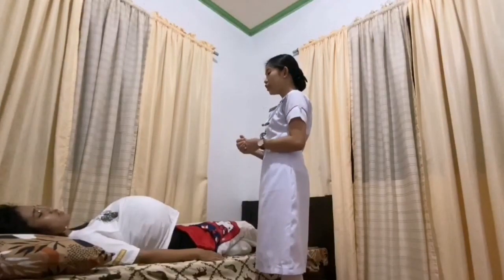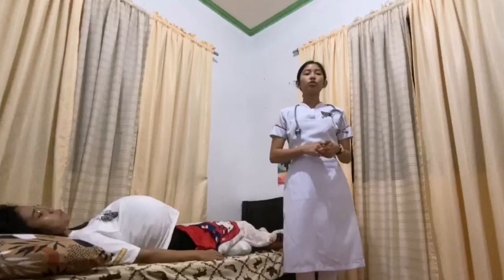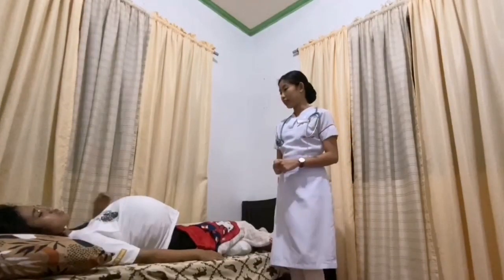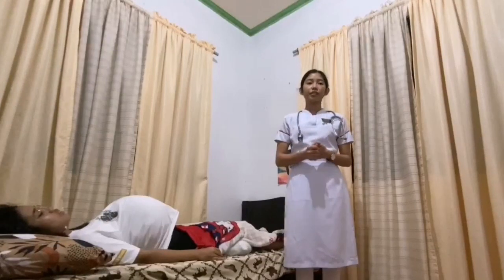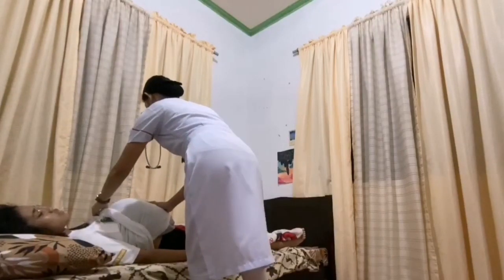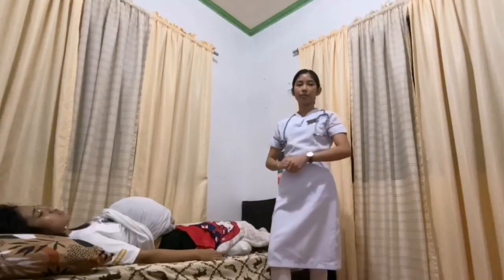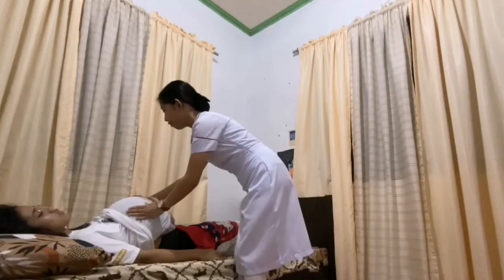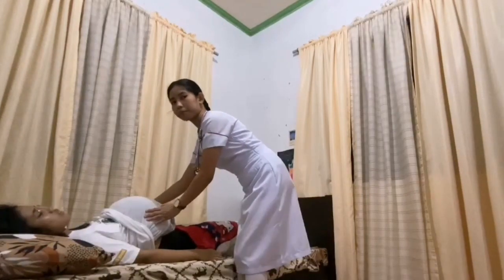Yes. Okay. In this procedure we are going to check for the baby's condition. Would it be alright with you, ma'am? Yes. The next thing is to find a quiet location and provide comfort to the patient. Let the client lie down on a soft surface and expose her abdomen for easy accessibility of the healthcare provider. After that is to feel the client's stomach and try to locate the baby's back — the midline is generally a good place to locate the fetal heart sound. In locating the fetal back, find the long hard structure, which is felt on the left side of the mother.